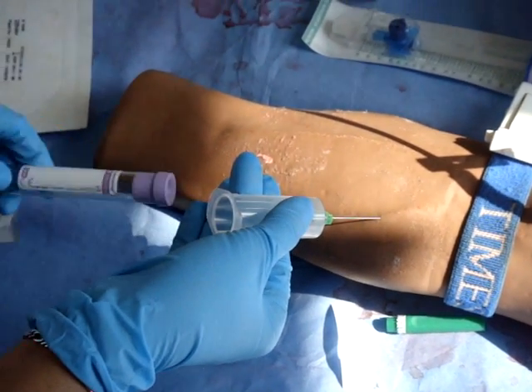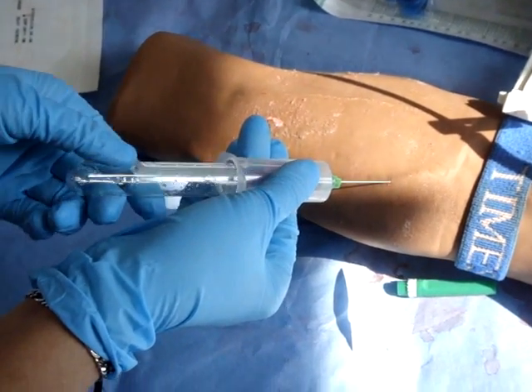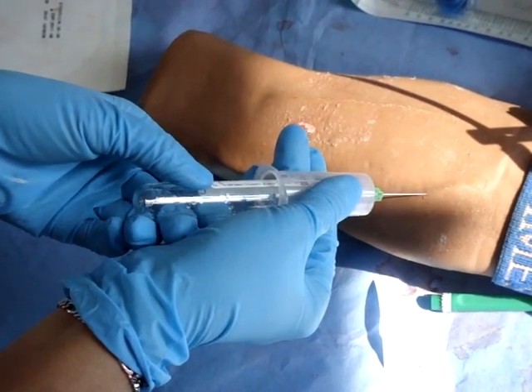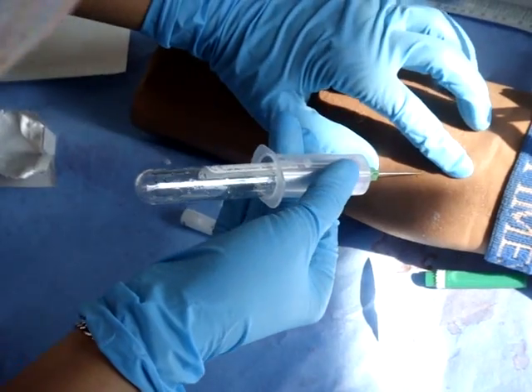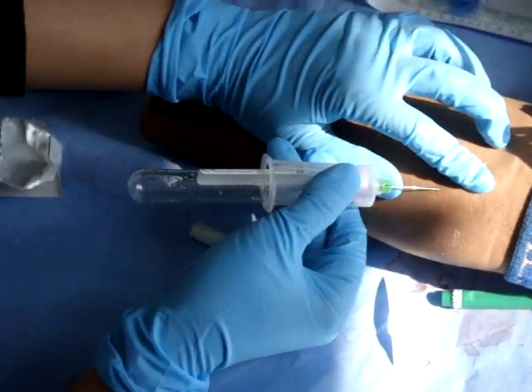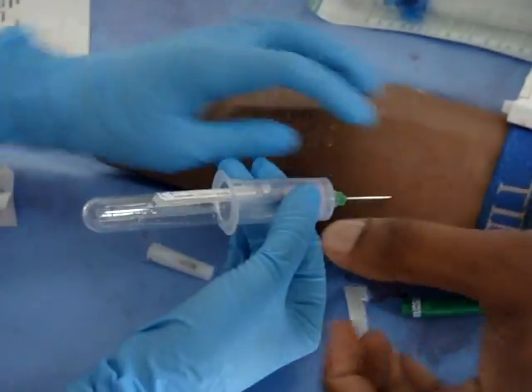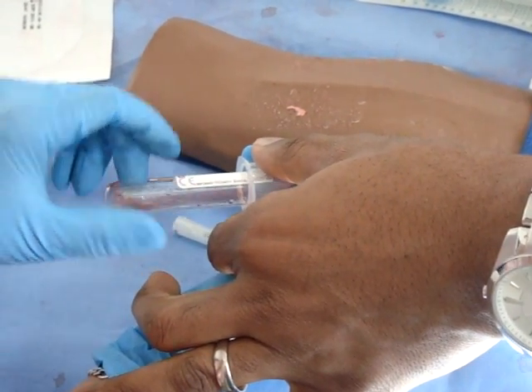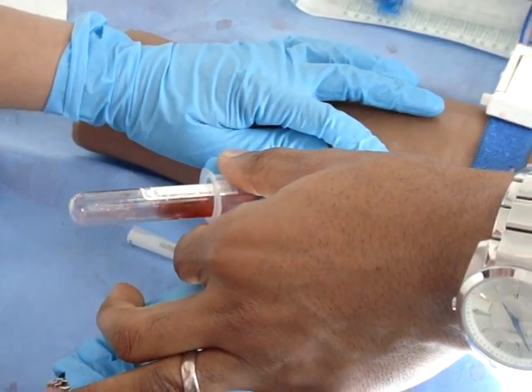Get a negative pressure vacuum tube and press into the syringe. You should get blood into the tube. Remove as much blood as required.